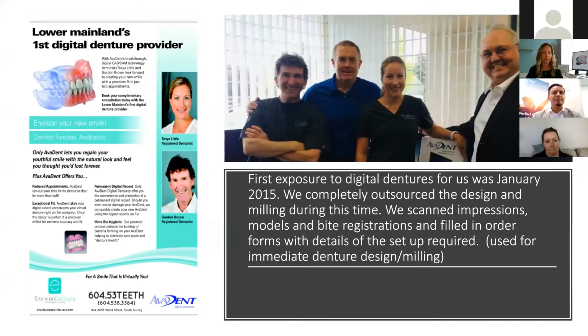We really fell in love with the ability to scan models and create immediate dentures this way. Obviously, aesthetically, 5 years ago, things weren't ideal, and we really used this scanner for immediates. And that was really our primary purpose. We didn't make any trays or anything like that we have the ability to do now. So it was interesting, when I created the slideshow, what we had to do 5 years ago, when we took an impression or if we had a model, we had to hot glue the impression of the model to like a tongue depressor and then seat it in the scanner.